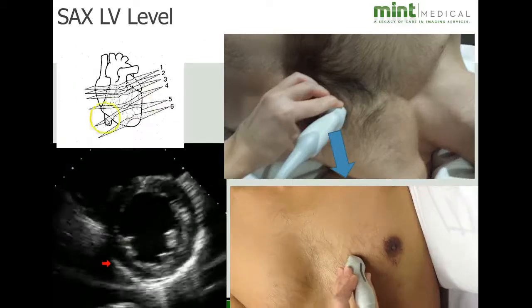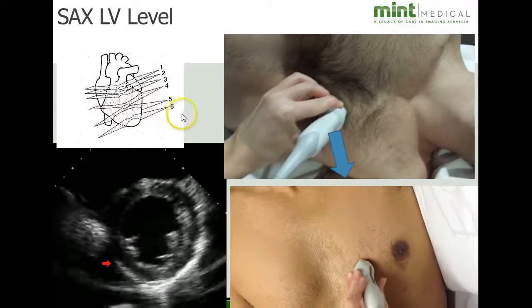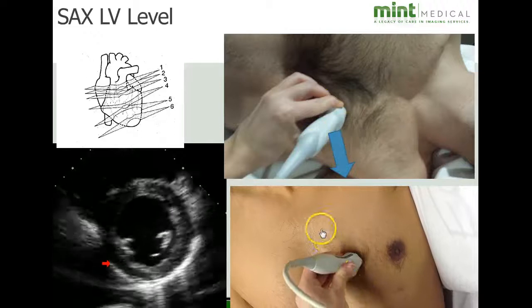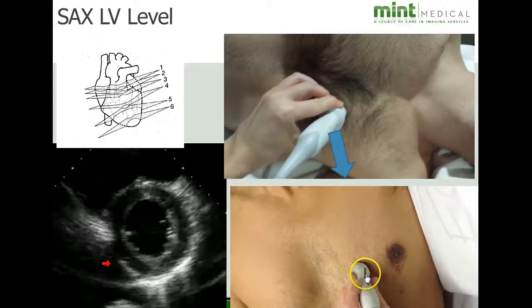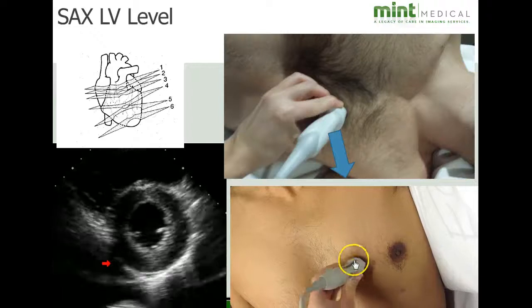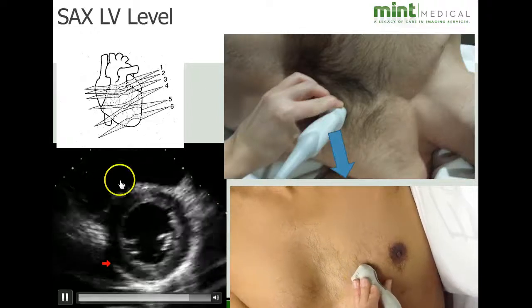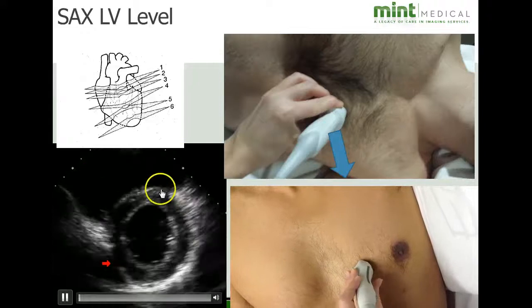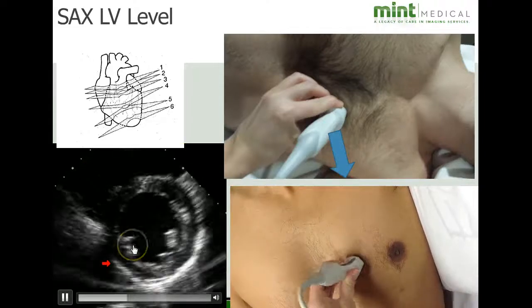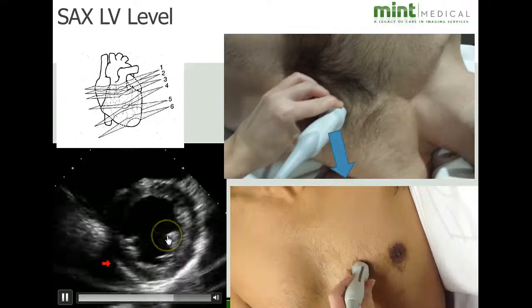The next level, you'll see the slices here towards number 5. This will be sliced left ventricle, and once again, your indicator is going to be in the exact same position, and you're going to be doing this sweeping motion. So once again, starting from the top, this will be the aortic valve level, mitral seen dead center, and then angling down towards the apex, you'll see the left ventricle. In this image, this will be the right ventricle, the interventricular septum, left ventricle, posteromedial papillary muscle, and anterolateral papillary muscles.